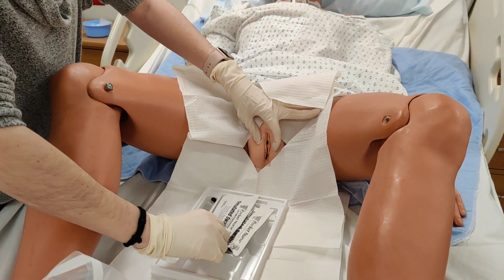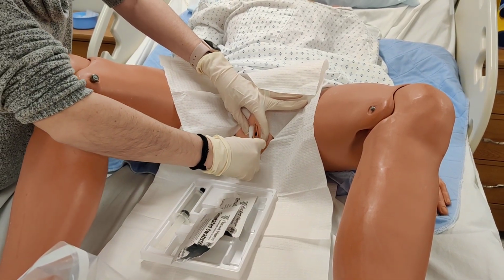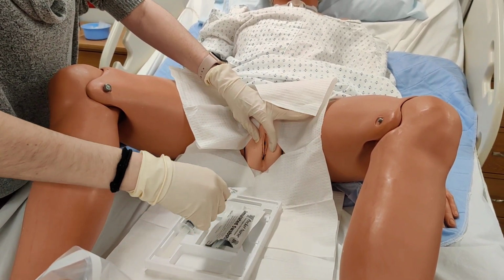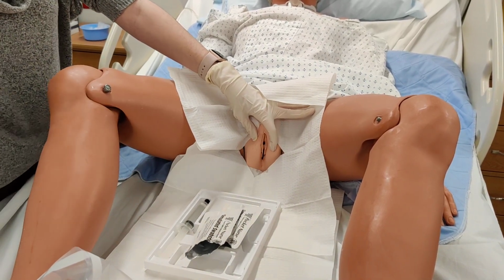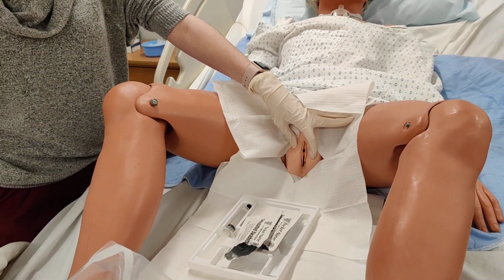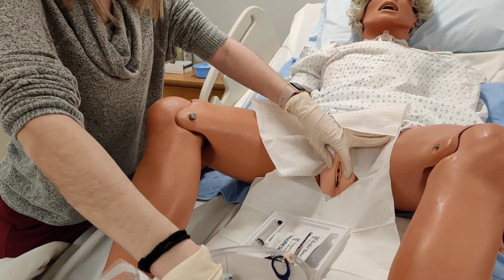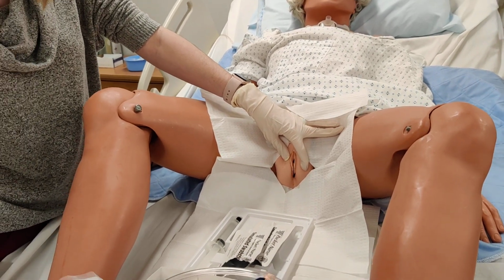Then she'll take another swab stick, and the labia closest to her, top to bottom 1 swipe. And the last swab stick will be used for the center. And she'll go once again, top to bottom 1 swipe. And she's discarded all of those swab sticks. Now she'll take the catheter. You can bring the whole box over to the field. It is okay if it overlaps, as long as everything inside that box stays sterile.